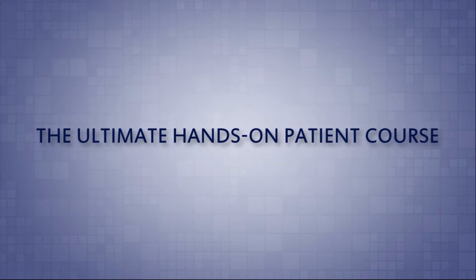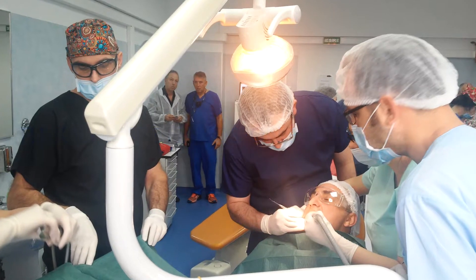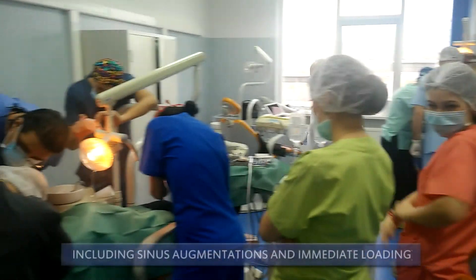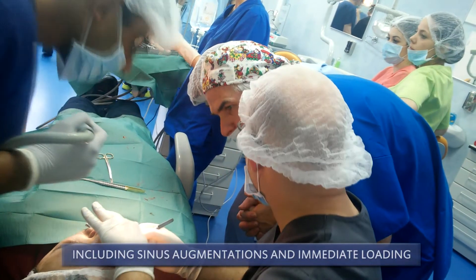The ultimate hands-on patient course — the leading international oral implantology course you've all been waiting for — performing dental implant surgical procedures on live patients.